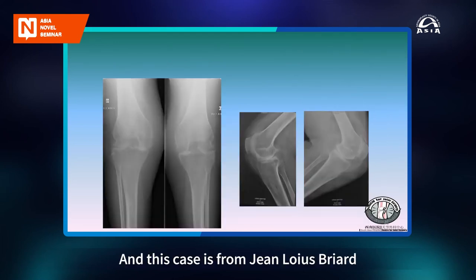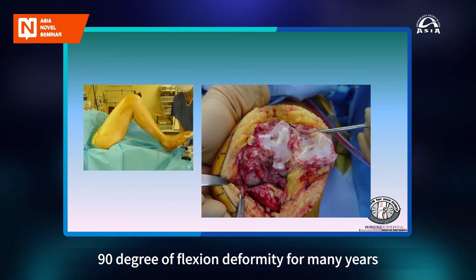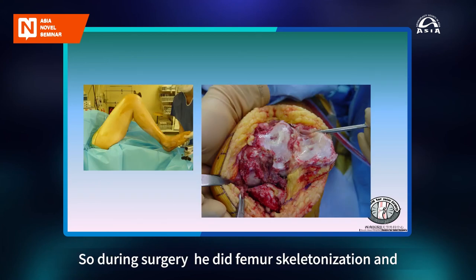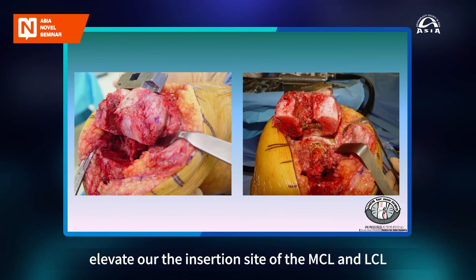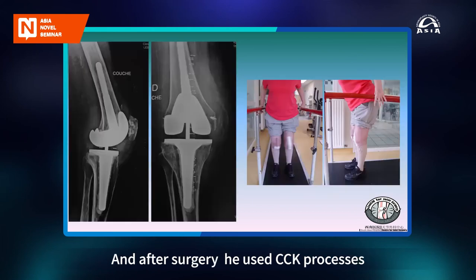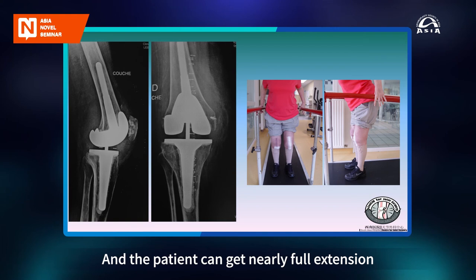And this case is from Jean-Louis Briard. He had a female case of bilateral 90 degree flexion deformity for many years. So during surgery, he did femoral skeletonization and elevated the insertion site of the MCL and LCL. And after surgery, he used a CCK prosthesis and tried to fix the bilateral ligaments. And the patient can get nearly full extension and over 90 degrees of flexion.